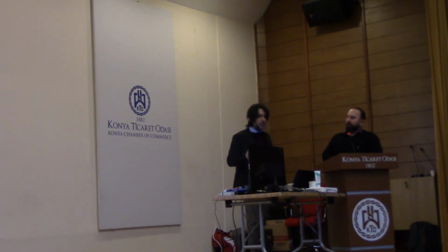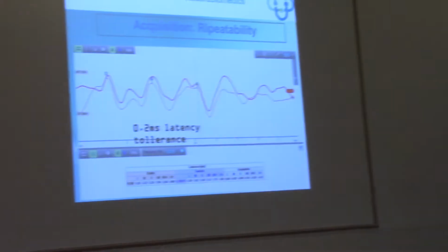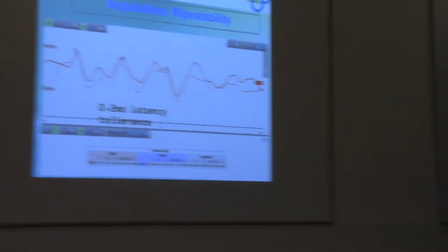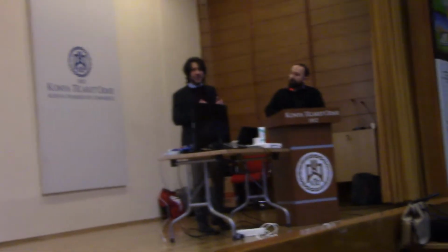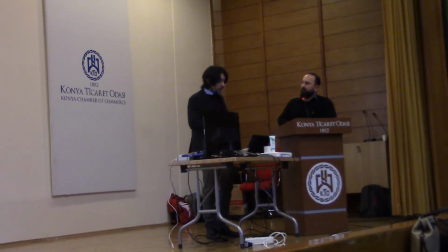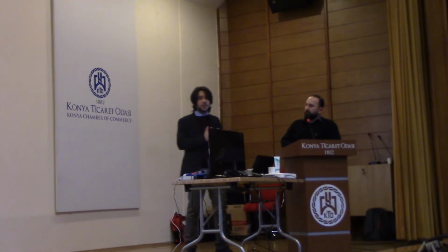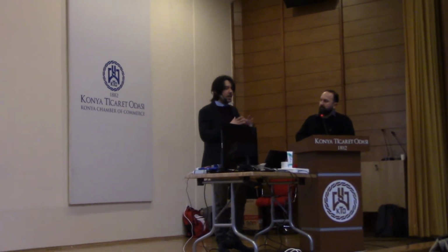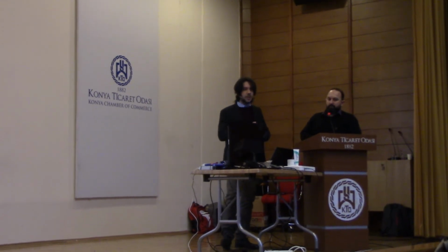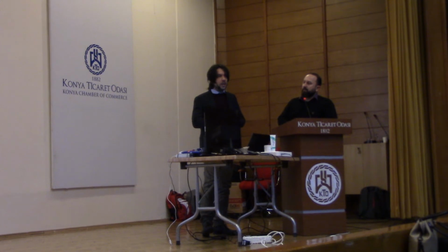So it's important for your repeatability that the total number of sums that they're using for each recording is the same for all the recordings. Because otherwise you have different parameters of comparison. And the latency in ABR should be approximately the same. You can have a tolerance of 0.2 milliseconds, no more, or 2 standard deviations, okay?